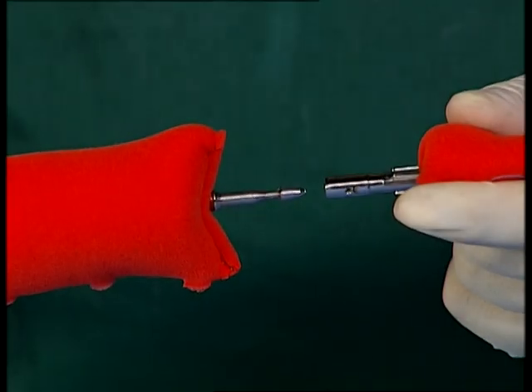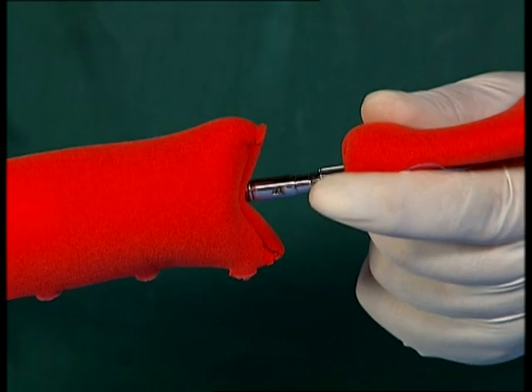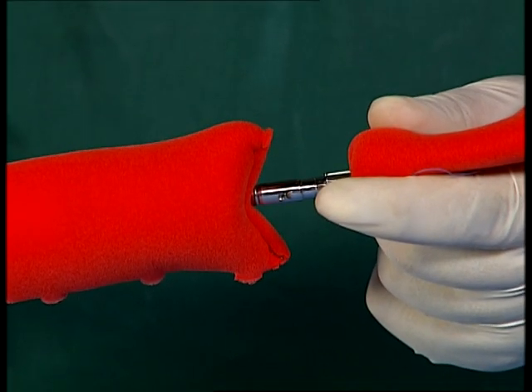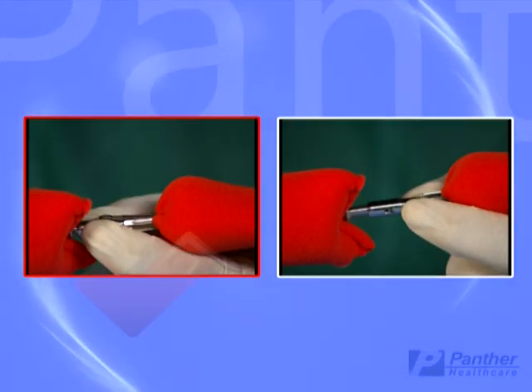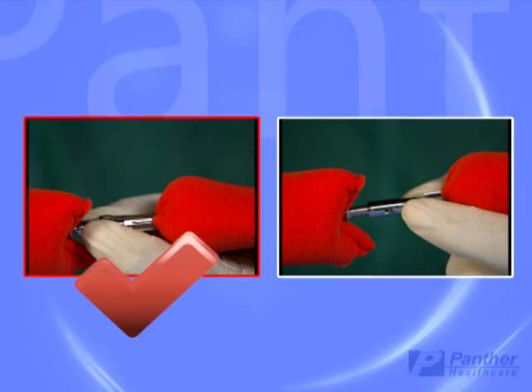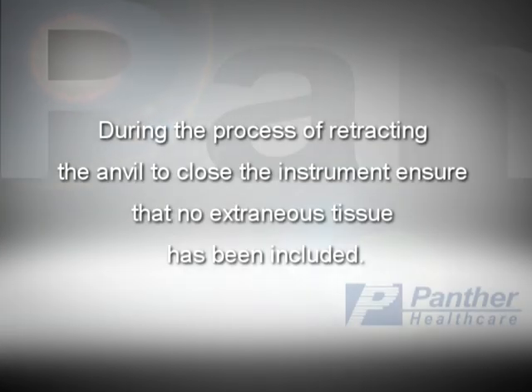The detachable anvil can now be reassembled to the instrument by sliding the anvil shaft over the trocar and pushing it until the unit snaps into a fully seated position. Exercise care to ensure that the locking springs are not clamped or gripped during the procedure to reattach the anvil assembly. During the process of retracting the anvil to close the instrument, ensure that no extraneous tissue has been included.